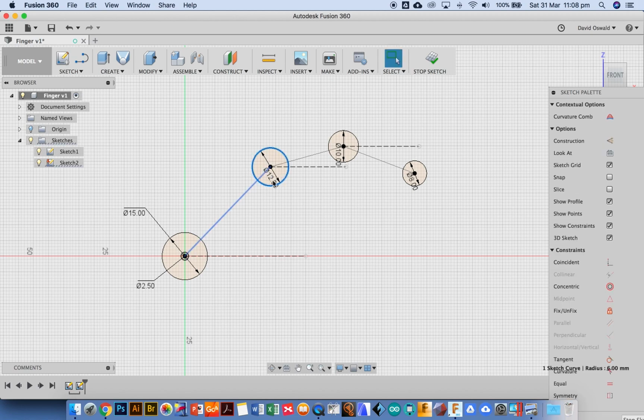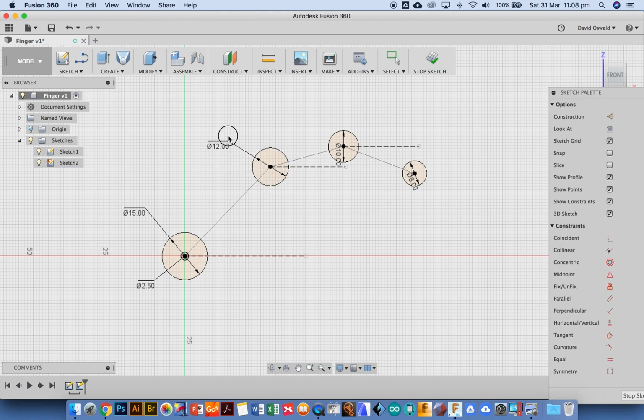Get them all clear of the object so that I can see them and if I have to adjust them later. What you do is click on them and then drag. Okay, so there's all of the circles that I need for my fingers. But I need the lines that join these. This is the stage you're going to have to spend a little bit of time on.